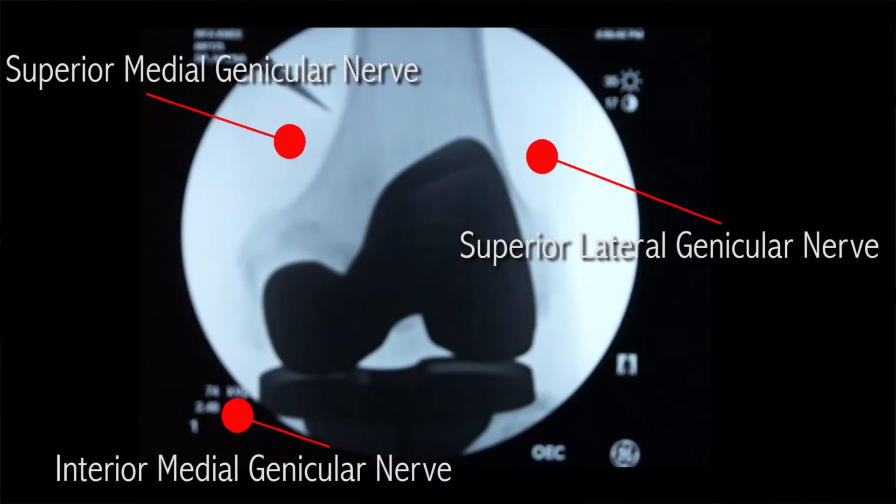This patient had a good response to the diagnostic block, and today we are performing the radiofrequency ablation. There are three nerves — the superior medial, superior lateral, and inferior medial genicular nerves — that we are going to ablate today.